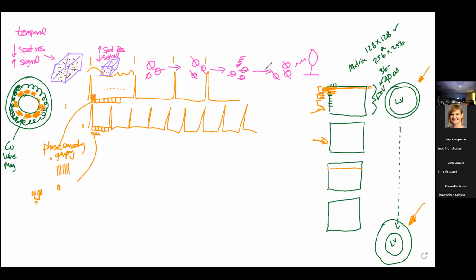All right? So when we come over to this area, we're only picking 3 at a time. Whereas here, we might have been grouping 6, 8, 9 at a time. And so your breath hold, because we've only got 3 at a time, is going to go up from 6 to 8 seconds to like 20 seconds. Well, that's not going to work, because who has a heart rate of 120 beats per minute? People with heart failure, LV dysfunction, they're going to be able to hold their breath less. But your collection intervals are twice as fast because the heart rate's gone up.